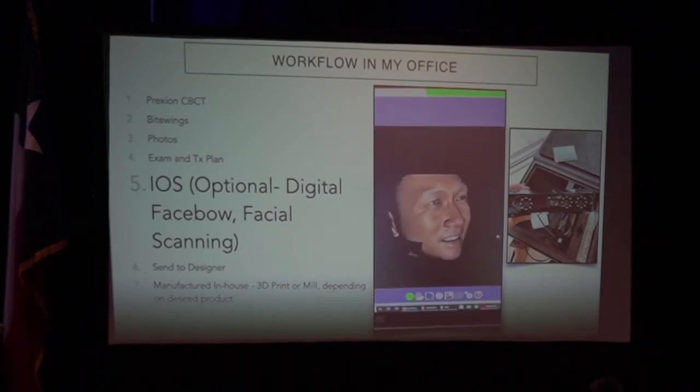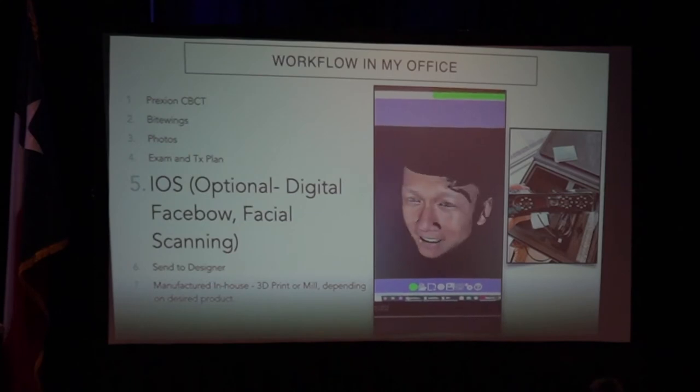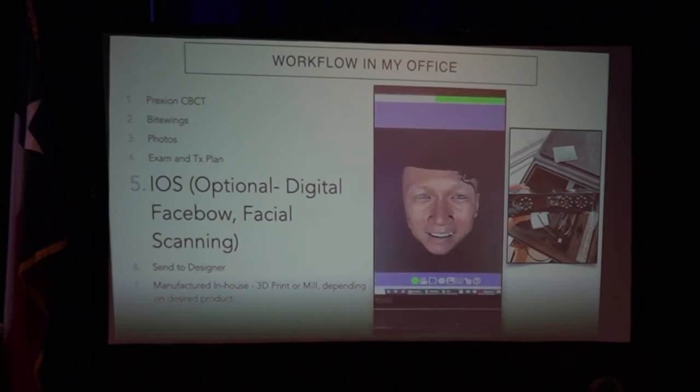But I've got this unit, and honestly, I don't use it that much. It's a little overkill, but since I teach digital workflows, I want to know all of the possibilities. If you take a distorted photo, that is why I bring this up. If I'm right here and you take a photo like this and you put that in your design software, this side's going to look bigger and this side's going to look smaller. Can you guys understand that?